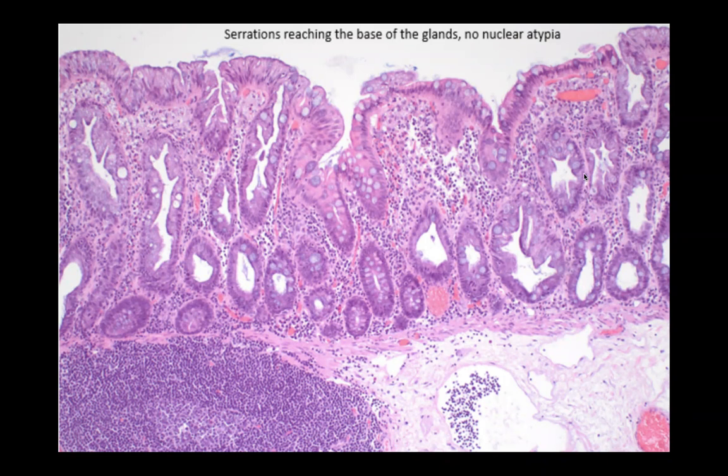And for labeling as sessile serrated adenoma, we need, besides the star-like aspect of the crypt opening, to see the boot-like appearance, the dilated bases of the crypts. Is this an obligatory sign for sessile serrated adenoma or not?